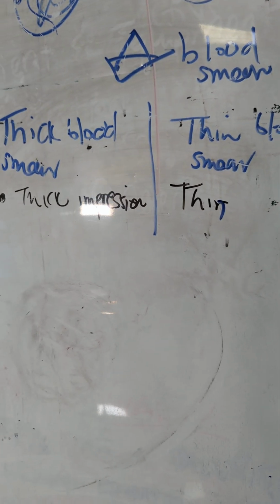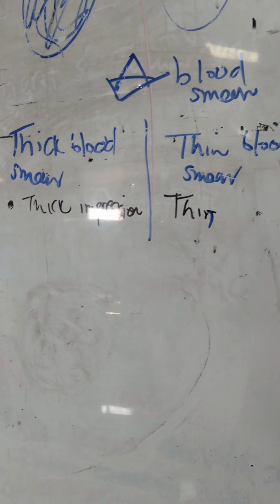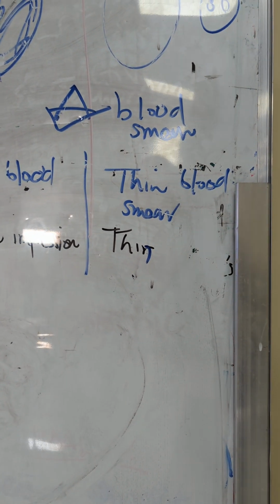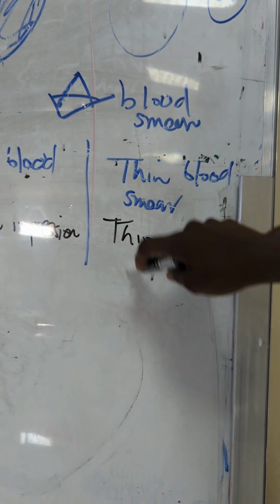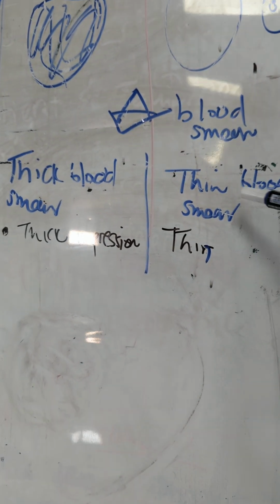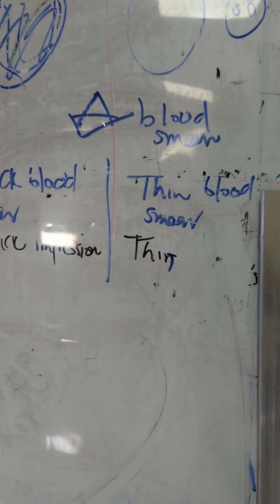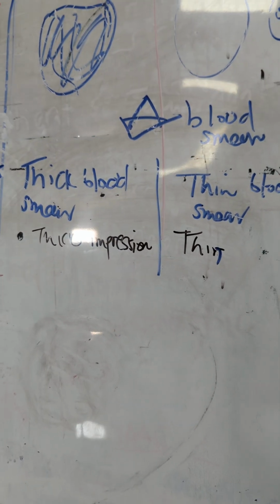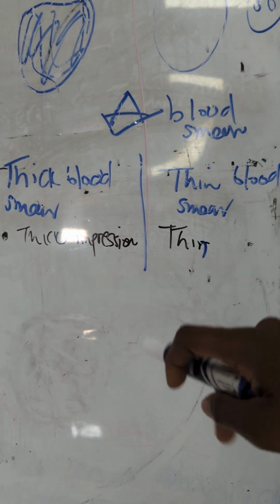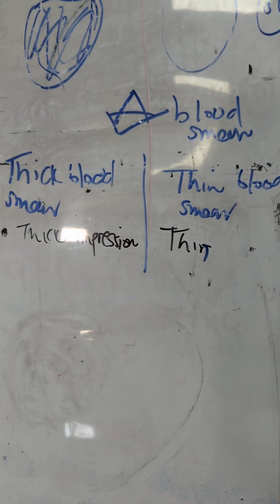But the most important distinction you saw for yourself in the microscope is that you have a preservation of red blood cells in the thin smear because of the way it is prepared, where we fix the slide in alcohol. That step preserves the red blood cells under your thin smear, so we're able to see the parasite inside your red blood cell.